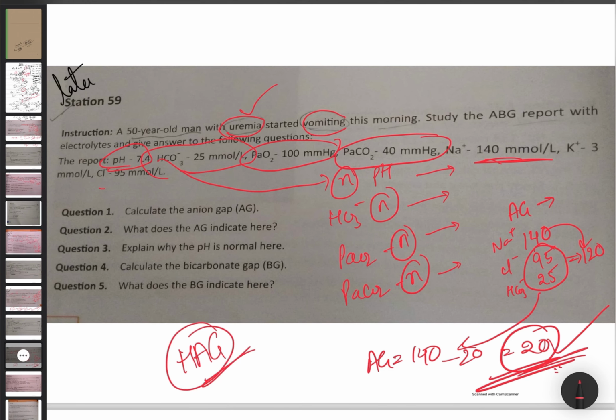I have already told you that if there is a high anion gap, you have to tell that this is metabolic acidosis. Even though everything is normal, a high anion gap shows metabolic acidosis. This is towards a higher range. You will not get such questions. You will get similar questions like we have discussed in the previous modules. This is ABGs for you.